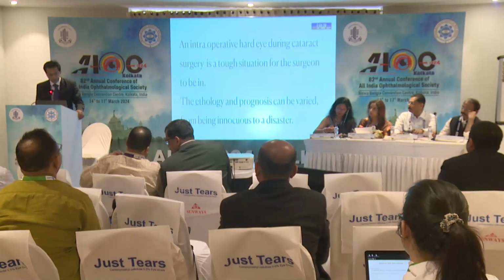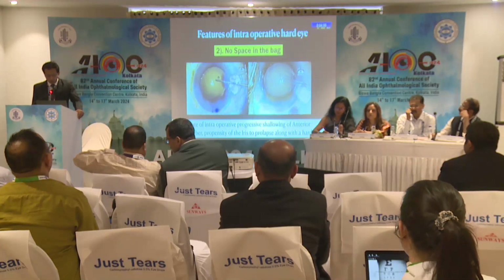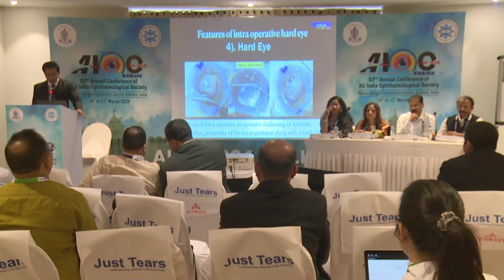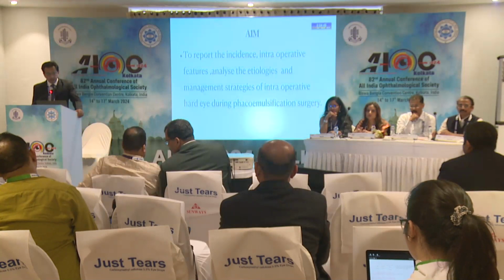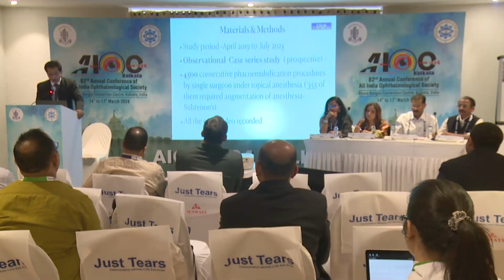Respected Chair, I'll be sharing my experience of intraoperative hard eye. It's a state of intraoperative progressive shallowing of the anterior chamber, with a propensity of the iris to prolapse out, along with a hard eye during phacoemulsification, and it's a tough situation to be in. We want to report the incidence, intraoperative features, and analyze the etiologies.